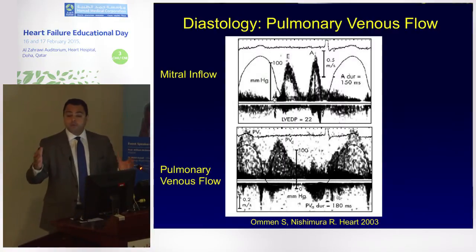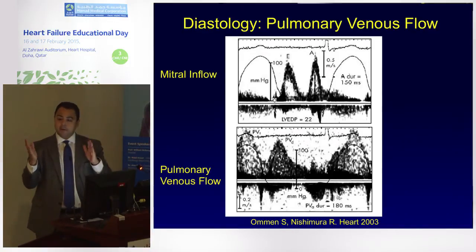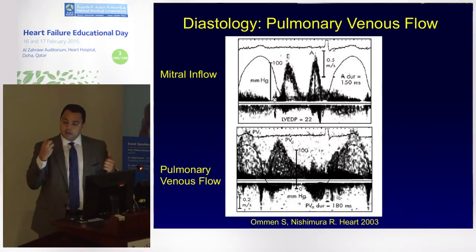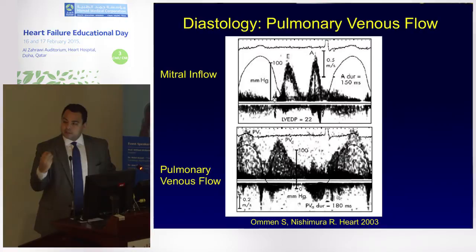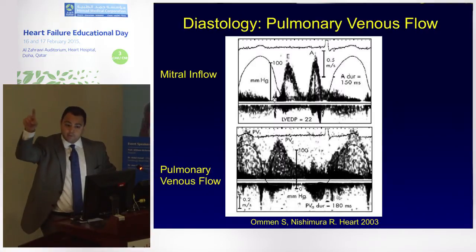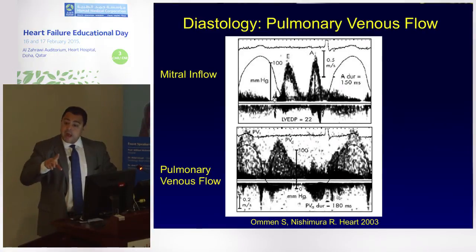Pulmonary venous flow is very important. You can forget all the memorizing of patterns; think of it this way. The pulmonary veins empty into the left atrium. So if I have a very lusitropic, hyper-relaxing ventricle, the LV has such suction, and in fact the early diastolic pressures, because of intrathoracic pressure being negative, are negative. So in early diastole, when the mitral valve opens, you have a continuous circuit from the LV through the mitral valve to the LA to the pulmonary veins, and you suck blood through the pulmonary veins into the LA and into the LV. So you actually have a high diastolic wave in the pulmonary veins.